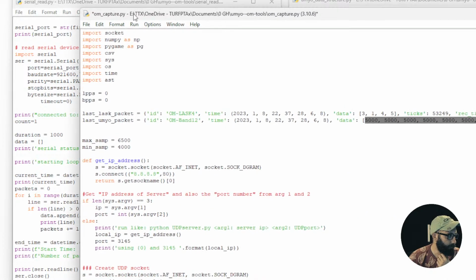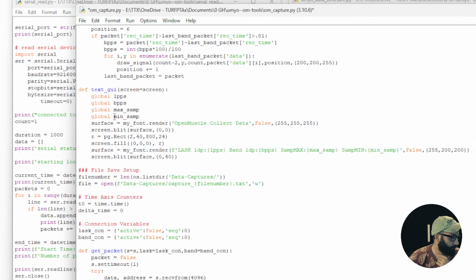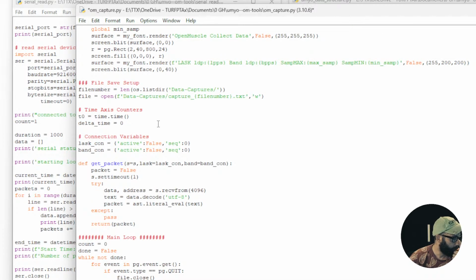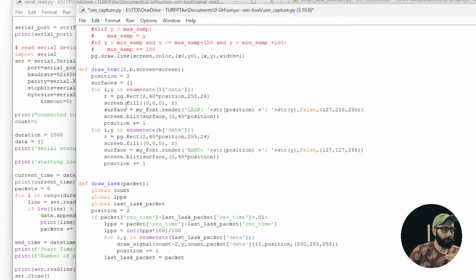So this is the OM capture. I don't think this one has the hand. Okay. So this one will capture only when both sequences, the LASK and the band, are connected. So I'm going to do this off stream. I need to now redo the capture for uMyo to pull in the data from the LASK and from it, and that's going to be kind of boring, so I'm not going to stream that.